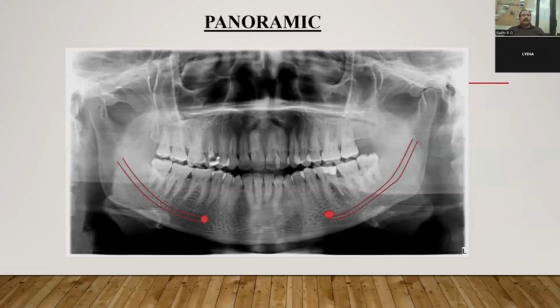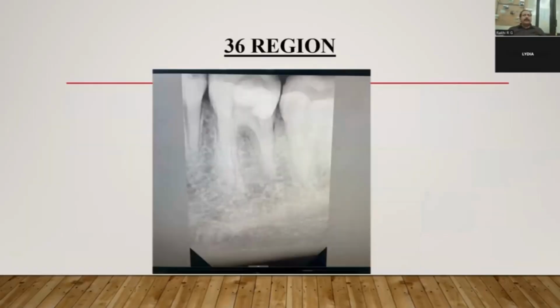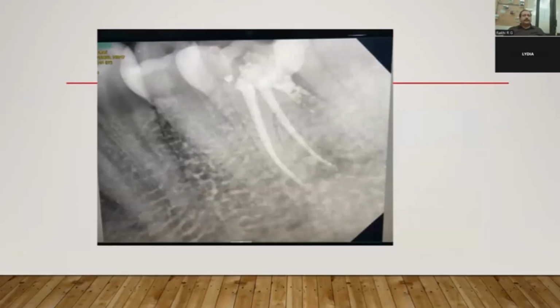Okay, so let's come to that IOPA and designing it. So you went in for an RCT. You retained the mesial roots. Yeah, can we see that? Yeah, after observation, that's how the condition is right now. So you have obturated two mesial roots wide apart. That is another favorable thing. You have two roots sharing the support. So when you see the crown of that mesial side, there is a retained crown on the mesial side, less on the distal side, which you are going to remove anyway.